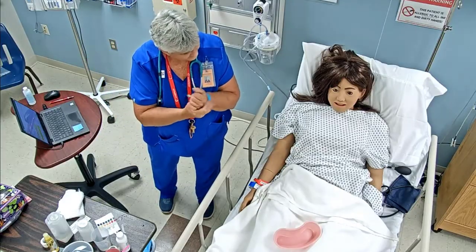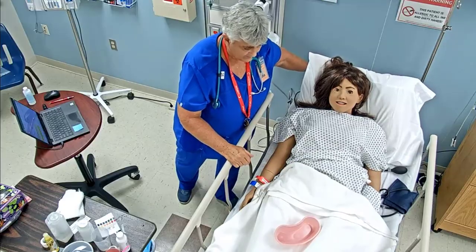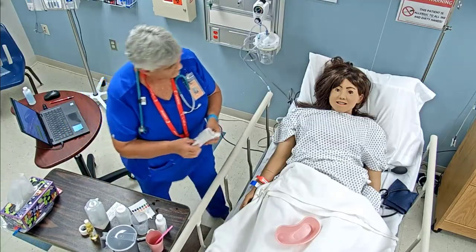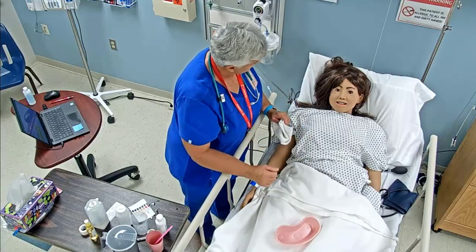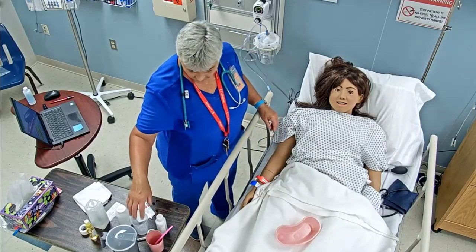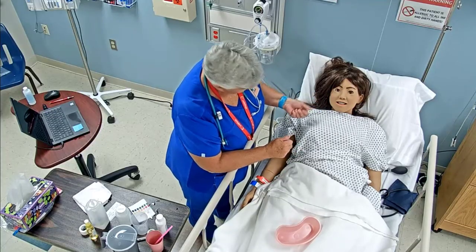Are you doing okay? Let me get you back in a comfortable position. I'm going to leave you about right there to begin with, all right? I'm going to give you a warm wash rag to wash your face. You have a tissue to blow your nose if you need to. We're also going to offer you to brush your teeth if you need to, or maybe rinse your mouth with some mouthwash.